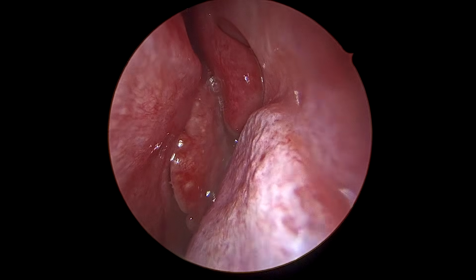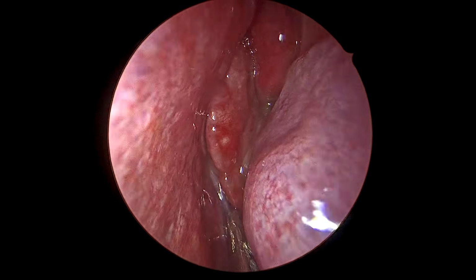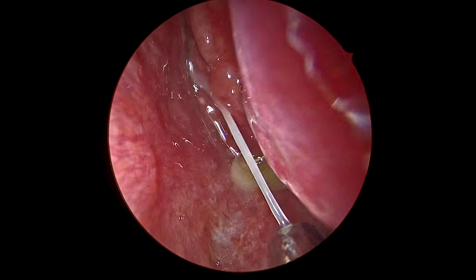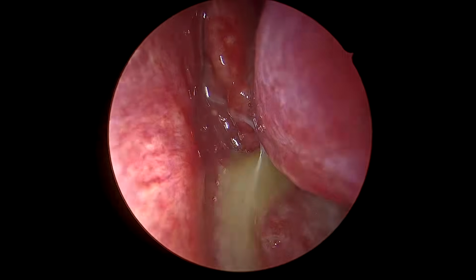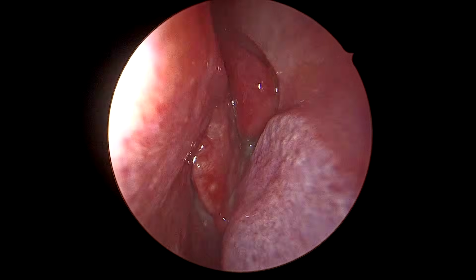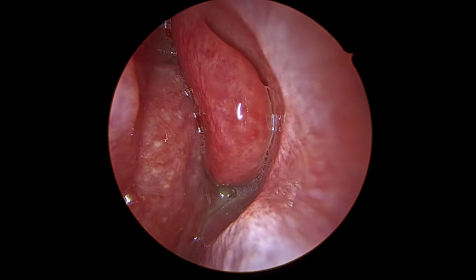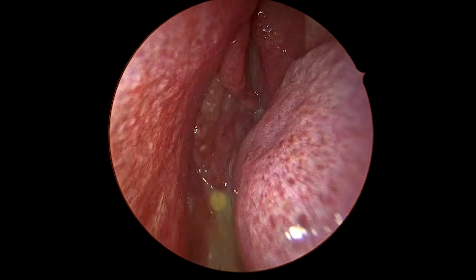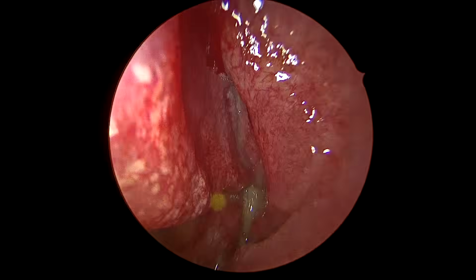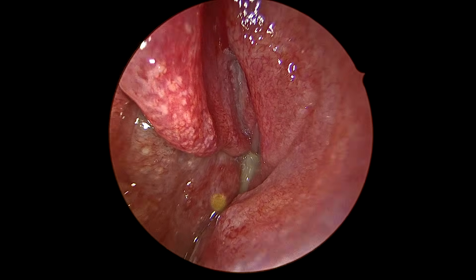So he came to me, and once I did the nasal endoscopy, I could see a pinkish mass completely occupying the left nasal cavity. It was present mostly, as you can see, on the medial aspect of the middle turbinate. It is touching the middle turbinate, filling the inferior part of the nasal cavity and going till the nasopharynx.